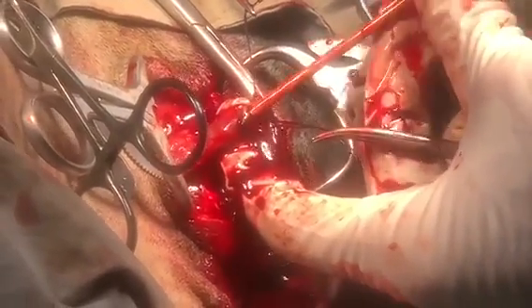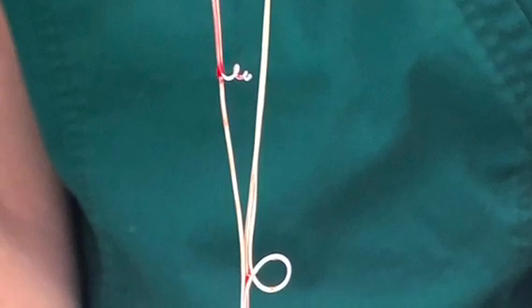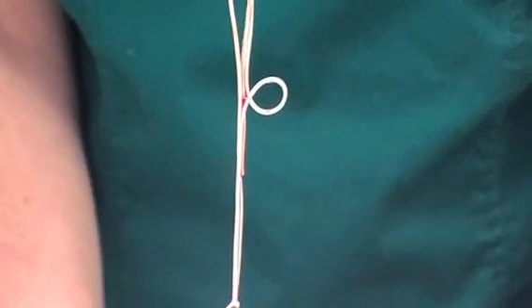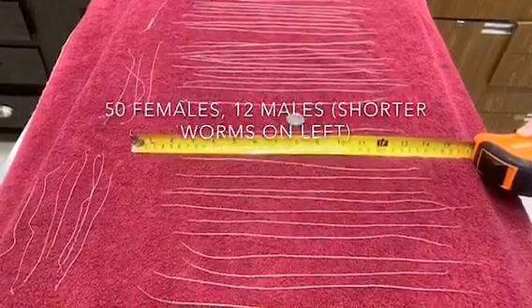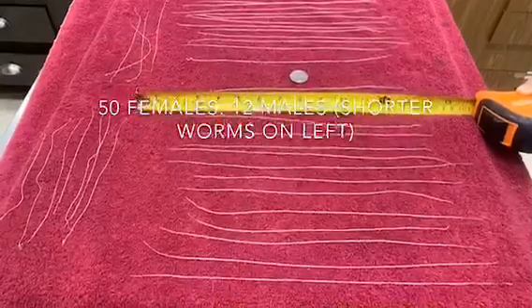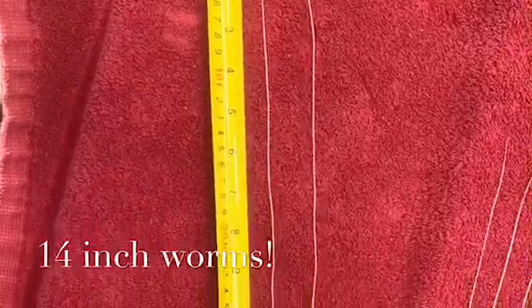We've got more — continuing to extract heartworms with the snare catheter, pulling out additional worms with each pass.